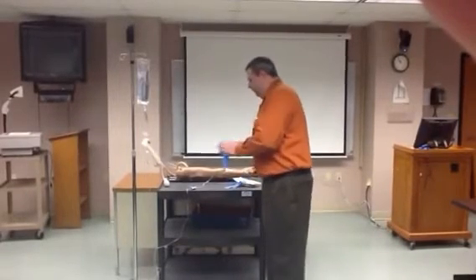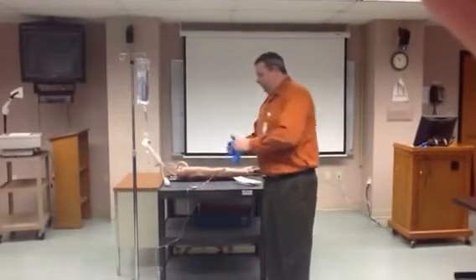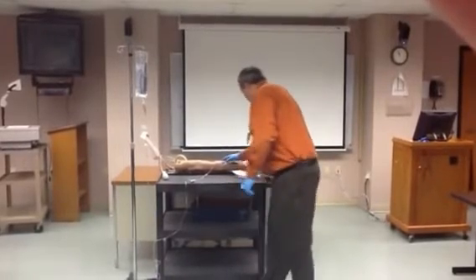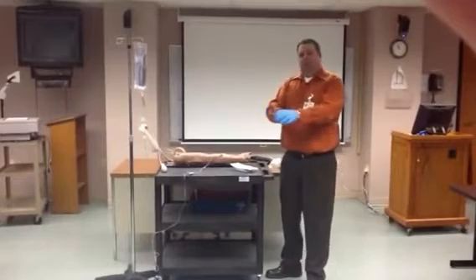The first thing I'm going to do is put on some gloves, and I'm going to assess the IV site for infiltration — edema, redness, swelling, all those kinds of things. I'm assessing it, and there's no edema, nothing like that. We're good to go. I'm going to remove my gloves.